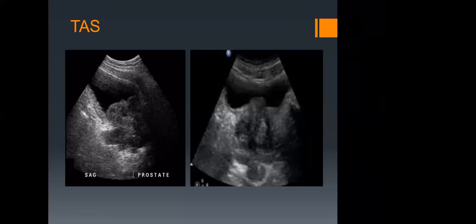But on our side, let's not be pathologists. Let's be experts in imaging. We are the eyes of medicine. Because we see this, the pathologist will not go to take a biopsy before there is an alert. For us, let's be alert of an impending danger. Do not put your two feet down to stamp that this is CA prostate. You can only suggest and alert. So this is the transabdominal appearance.